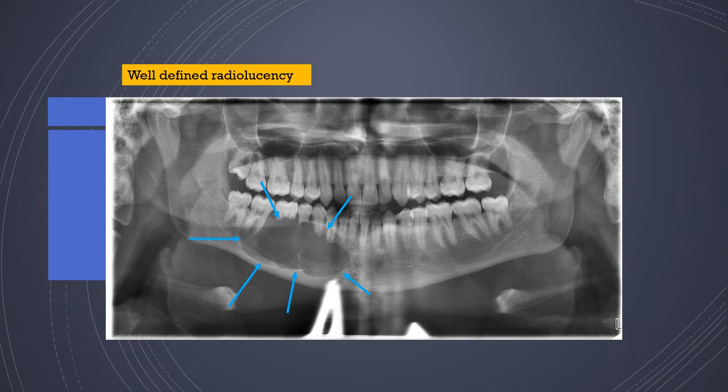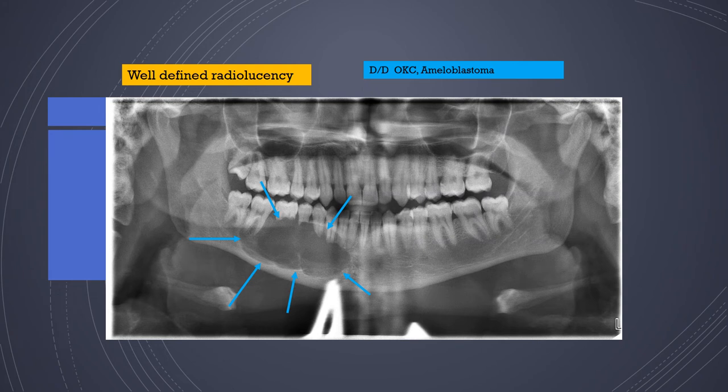Here are more well-defined radiolucencies. This large radiolucency is nearly 6×3 cm in size with a scalloped appearance and multiple locules. The borders have caused resorption of adjacent teeth. This would definitely be an OKC or an ameloblastoma. It is very important to assess how close it is to the mandibular canal — and in this case, the mandibular canal is involved.